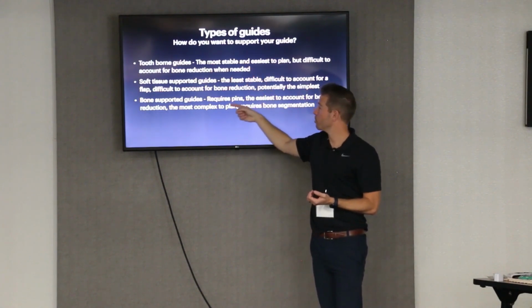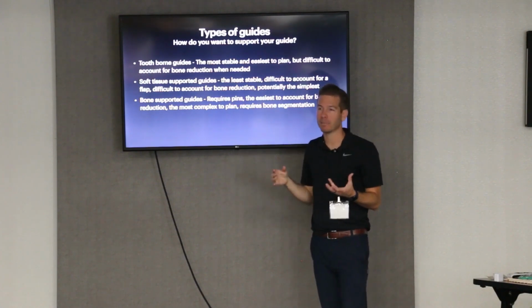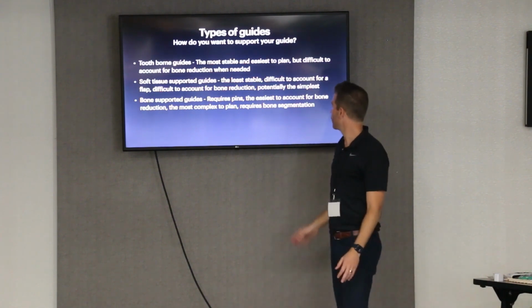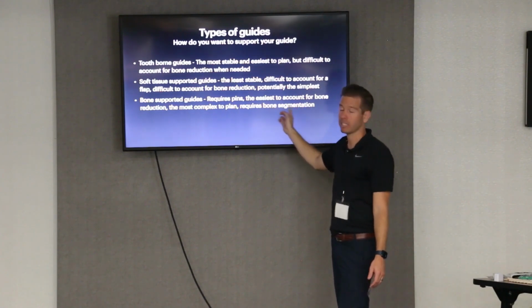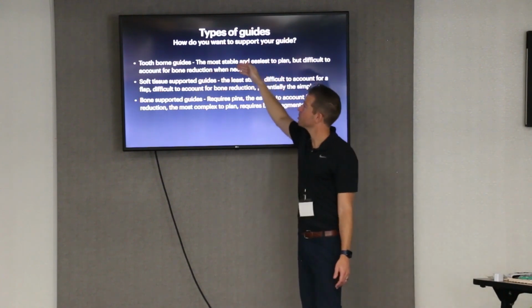And then bone-supported guides are the most complex. They're going to require pins because you're going to be pinning it into the bone. This is what you do for bone reduction guide, but it's the most complex to plan, and then it requires this thing called bone segmentation, which I'll talk about in a second. But this is what I want to teach.